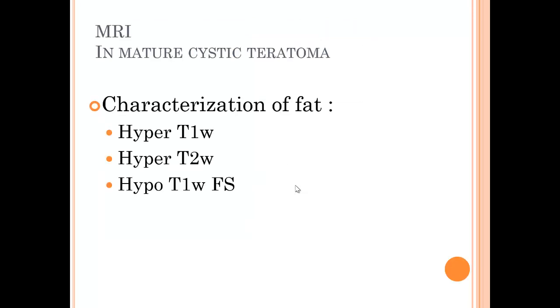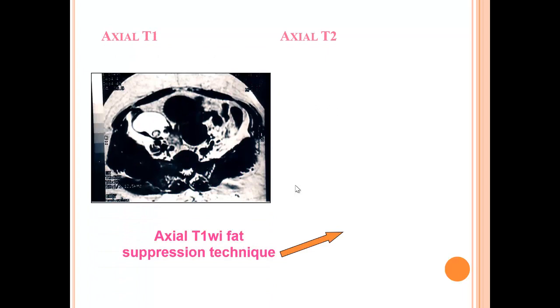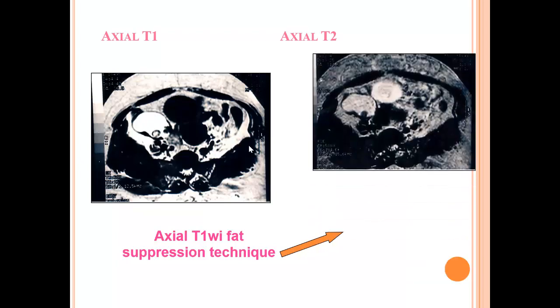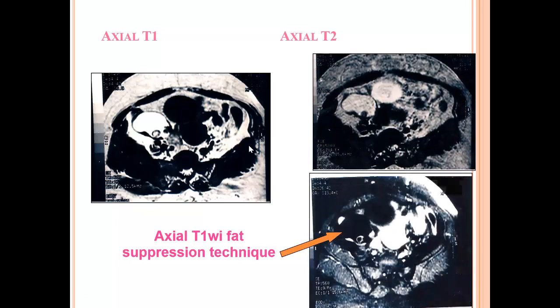On MRI, mature cystic teratoma has a typical appearance: hyperintense on T1, hyperintense on T2, and hypointense on fat suppression. In this case you can see the crown of a tooth present inside. Although on ultrasound it was completely anechoic, it still has a fat component — bright on T1, slightly bright on T2, and completely suppressed on fat suppression.